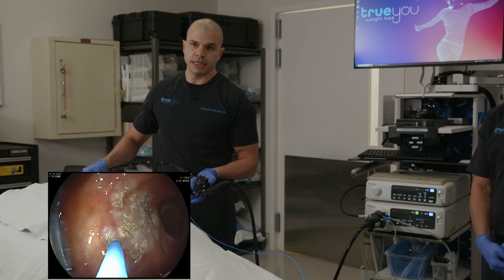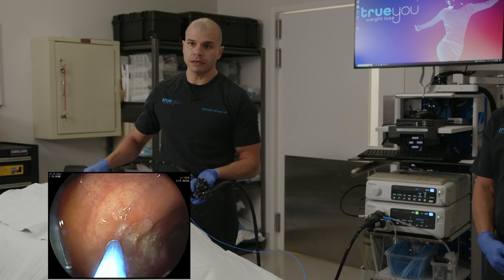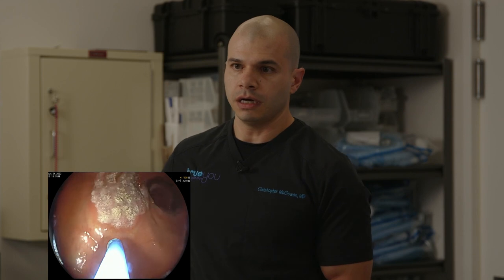But over the years, she's regained due to a variety of factors, life events. You know, things can get in the way, things can happen, but ultimately lost that sense of restriction. And so she's not returned to her prior baseline weight, but the weight has been creeping back up, so she's looking to get back on track. And I've nearly finished this ablation process. So this is the region that I will be suturing in a moment. I'll take another question now.